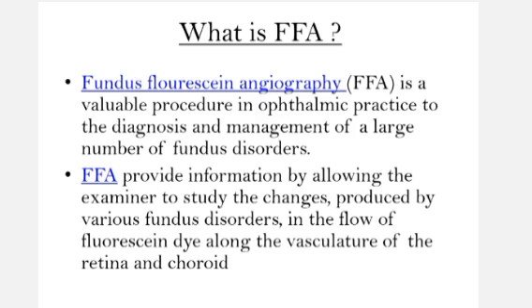So, FFA provides information by allowing the examiner to study the changes produced by various fundus disorders in the flow of fluorescein dye along the vasculature of the retina and choroid.